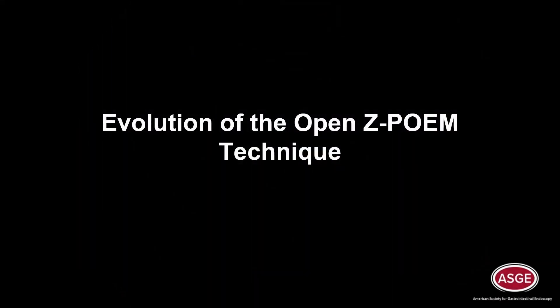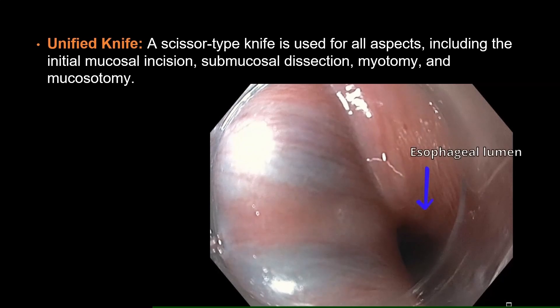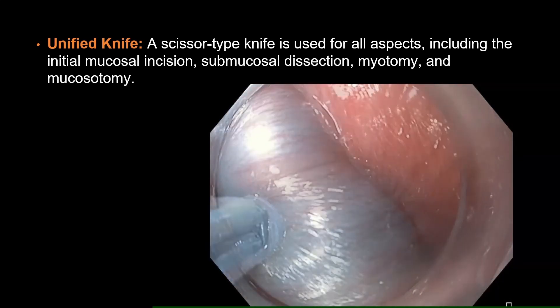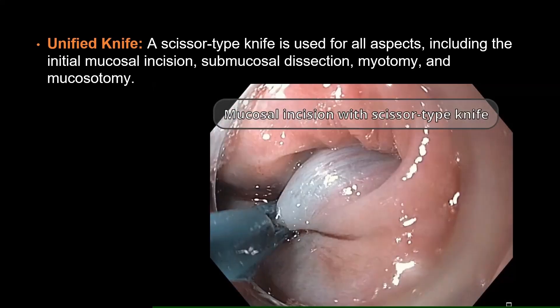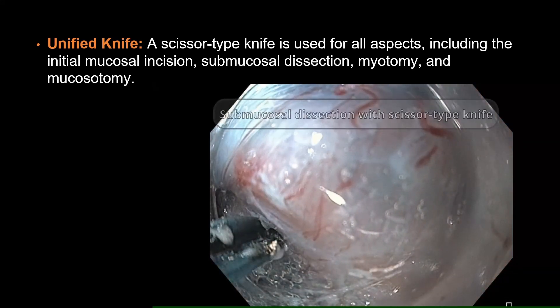To refine the open ZPOEM technique, some key enhancements were employed. A scissor-type knife can be used for all aspects, including the initial mucosal incision, submucosal dissection, myotomy, and mucosotomy.